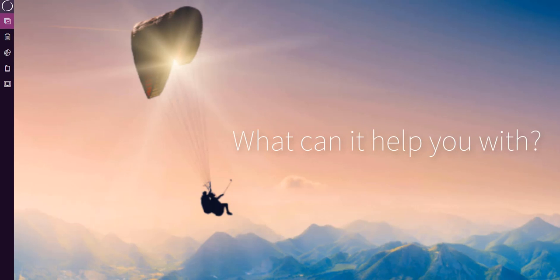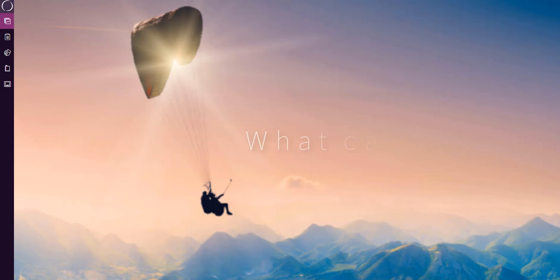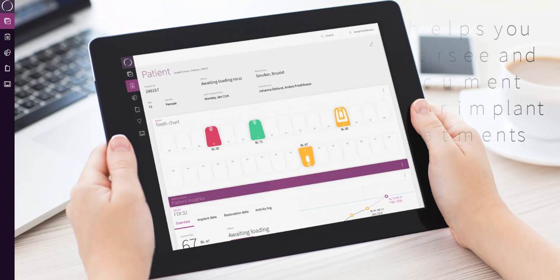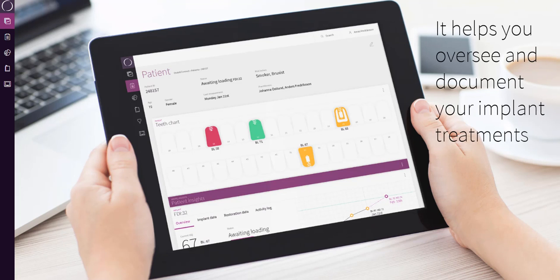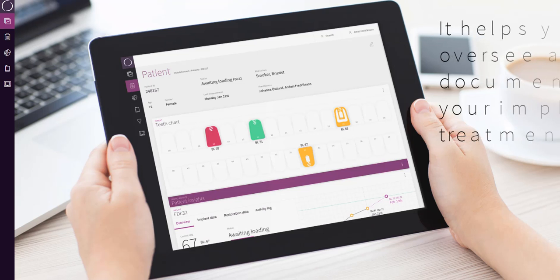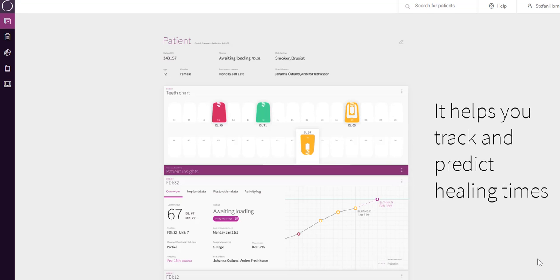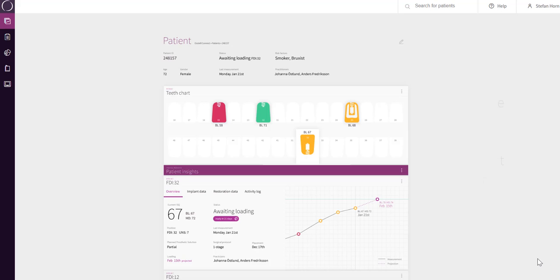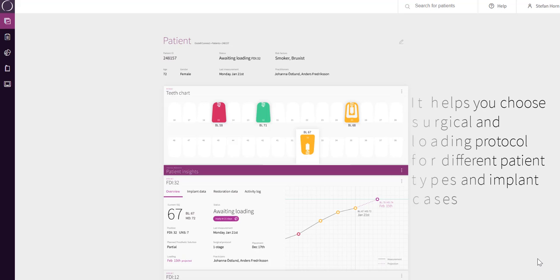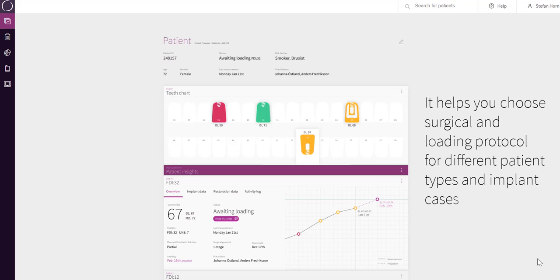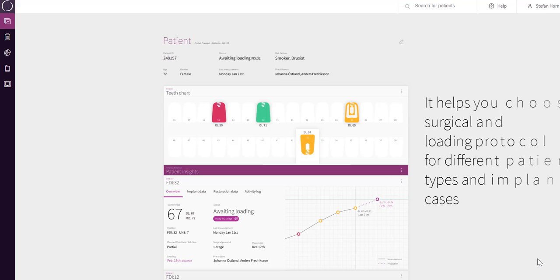What can it help you with? It helps you oversee and document your implant treatments. It helps you to track and predict healing times. It helps you choose surgical and loading protocol for different patient types and implant cases.